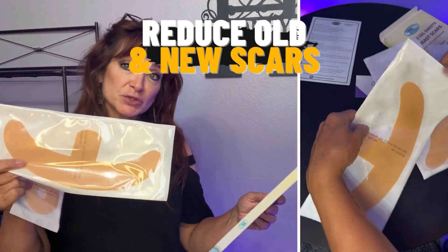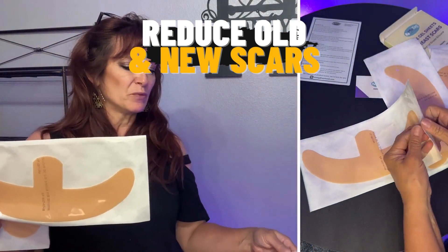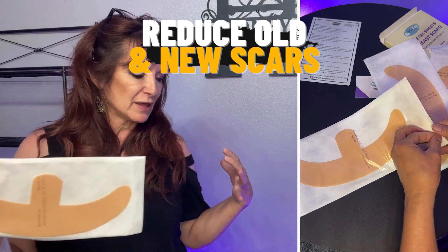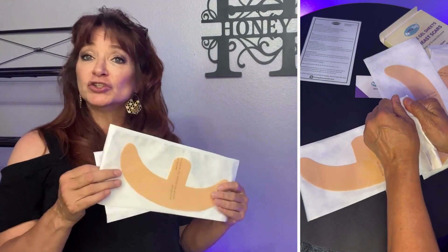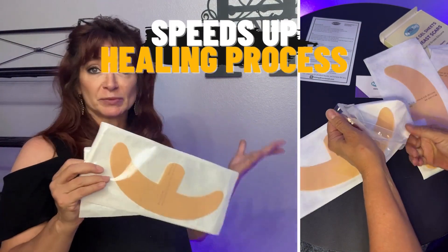This is going to reduce scars by creating a bit of a moisture barrier and an environment that increases the collagen production to help heal a little bit faster. And you can use these on new scars or you can use them on old scars.